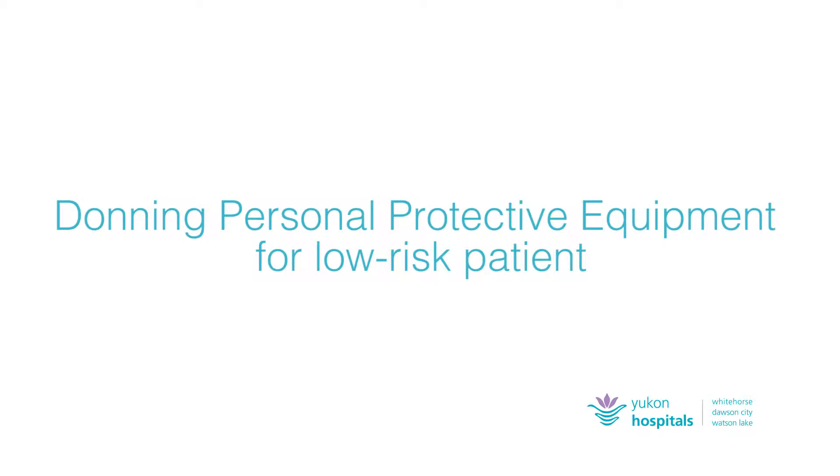This video demonstrates the proper procedure to don personal protective equipment when caring for a dry or low risk Ebola patient on contact and droplet precautions. It should also be followed when you assist another care provider in donning their own PPE.